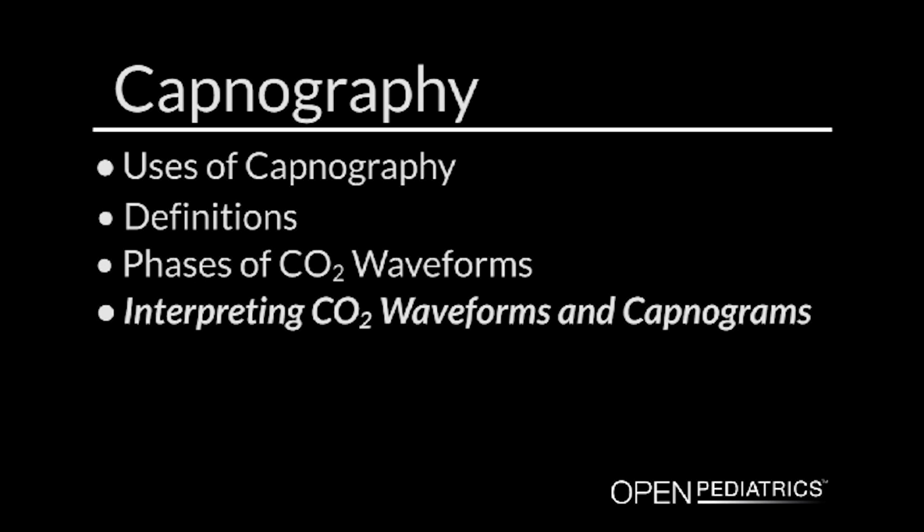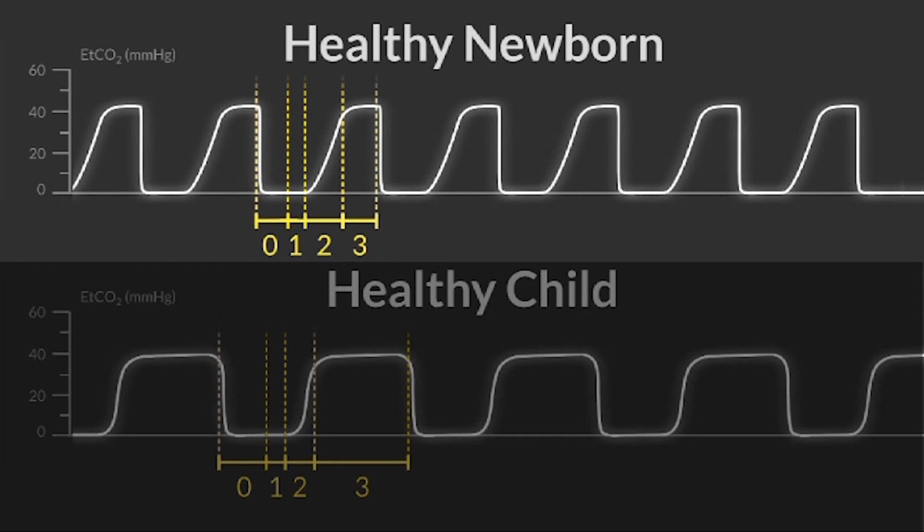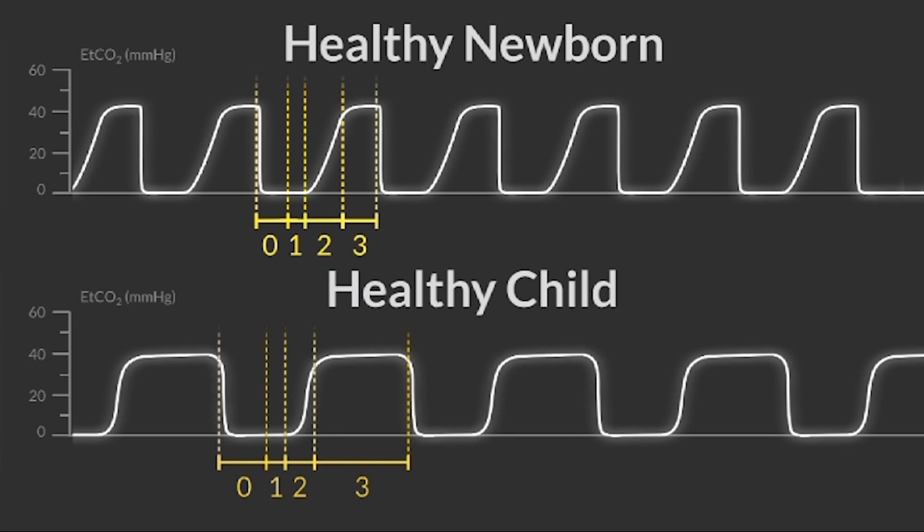Interpreting carbon dioxide waveforms in capnograms. We're now going to walk through interpreting capnograms in patients of different ages and physiologies. First, we will look at a healthy newborn capnogram as compared to a healthy pediatric capnogram.